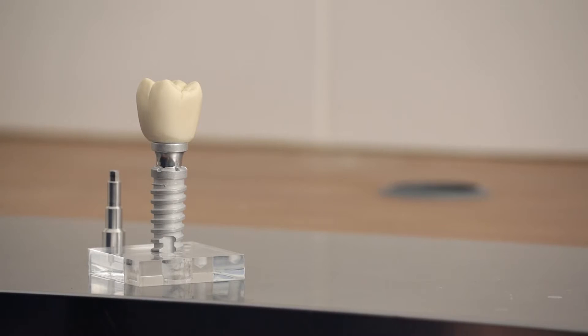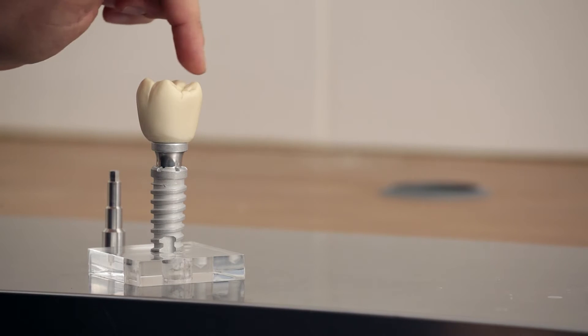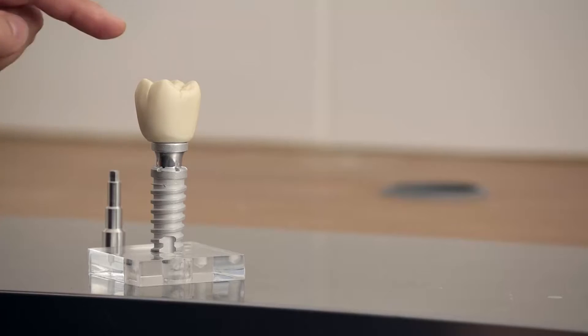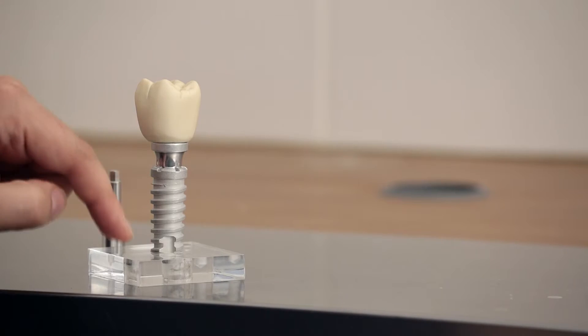Once it's been confirmed that this has actually fused with the bone, then we need to actually construct the tooth that's going to be supported on the implant, and it's also going to be able to restore the function and the aesthetic appearance of the missing tooth. So it's very important that one considers that all these parts are needed in order to have a tooth replaced.